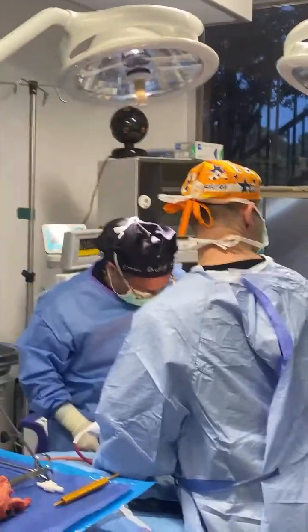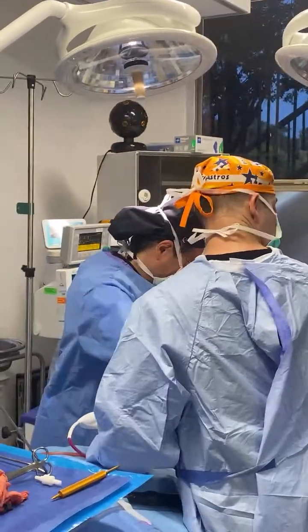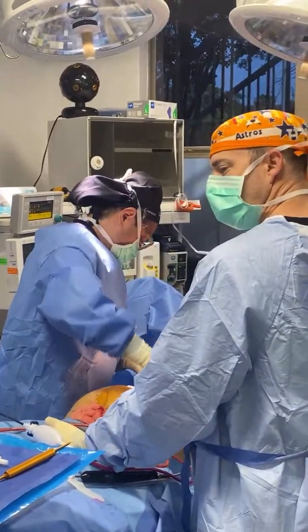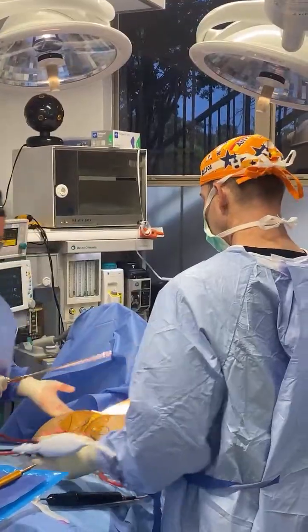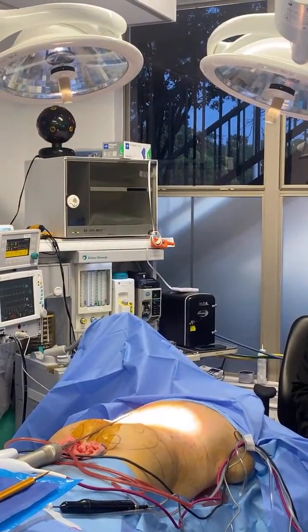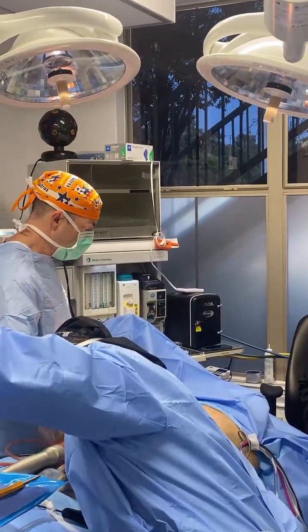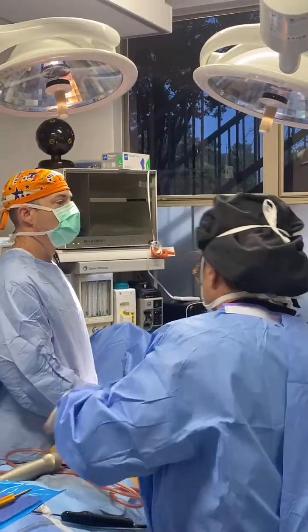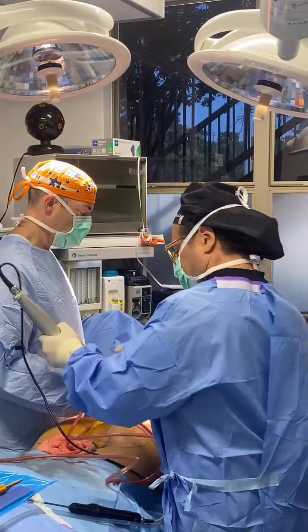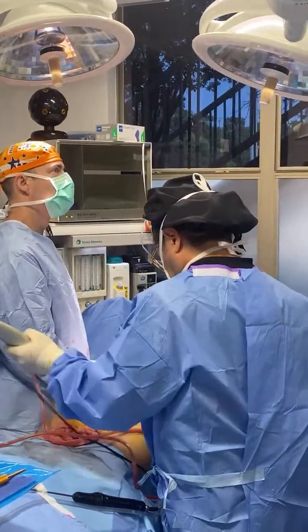We're finishing our second part of our first surgery of the day. We started with lipo 360 on our patient, so we took some fat from her abdomen and the sides, and we took a break, flipped her onto her stomach, and now we are going to take all that fat and put it into her butt for that lift. And then we're going to go in with Renuvion, and that's just going to help tighten the skin where we took fat to give a younger skin appearance, is the best way I would describe it.